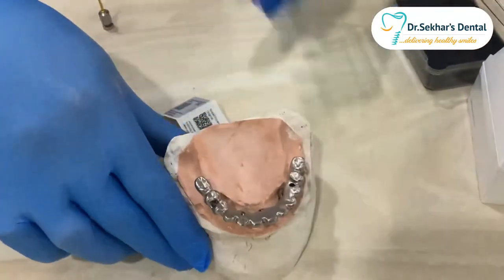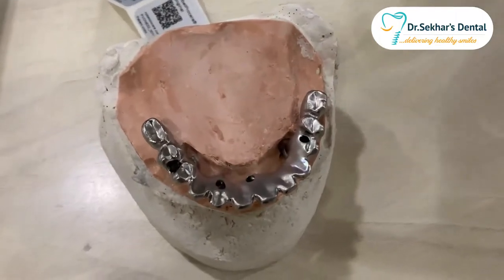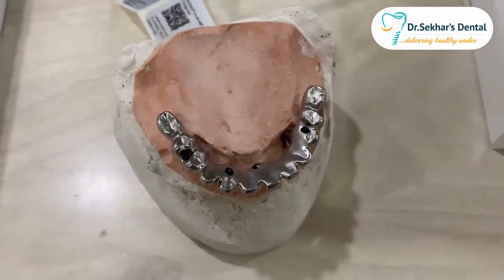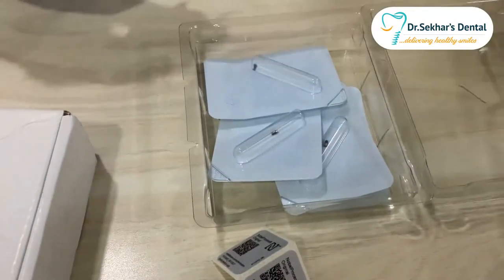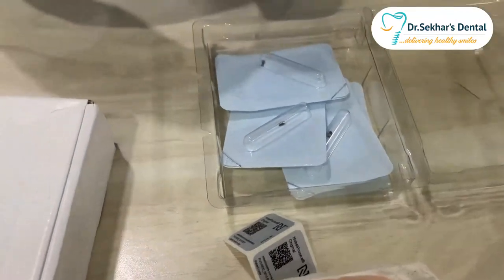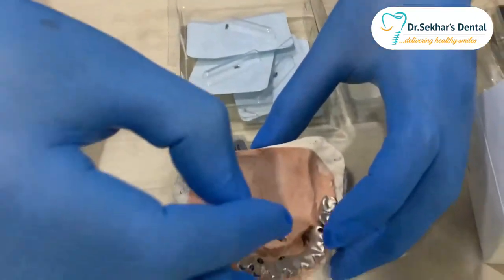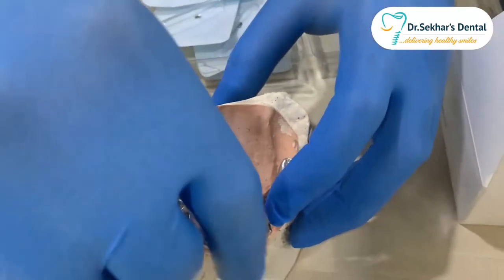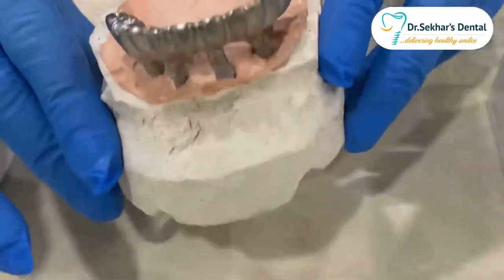I want to check with a single screw test. Noble provides clinical screws along with this frame, but I want to use those only at the final delivery of the process. Till then I will use my lab screws. I'm using one now to check the single screw test.